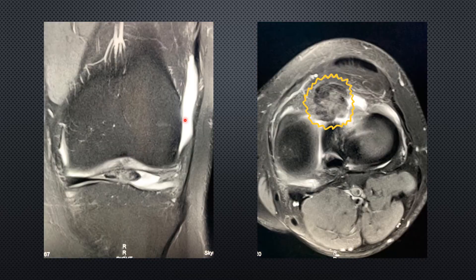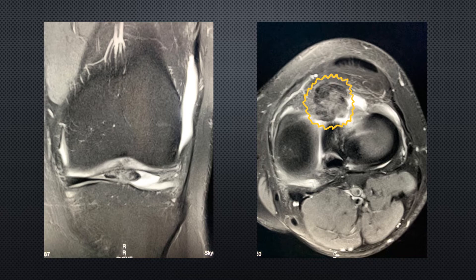On the coronal T2 fat-suppressed image, we can see this lesion right at the infrapatellar fat pad, and again appreciate the low T2 signal intensity. On axial proton density images with fat suppression, we again see the same mass at the infrapatellar fat pad. It is visible in all sequences and is easy to identify as a well-defined, encapsulated mass.